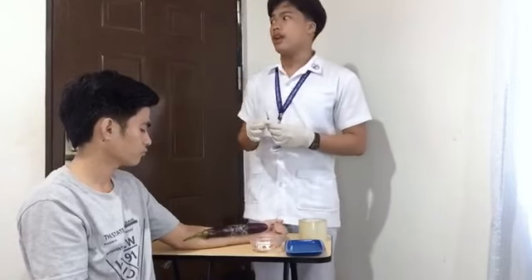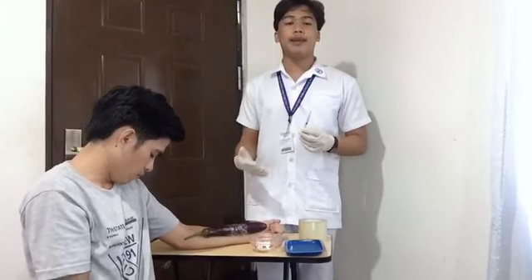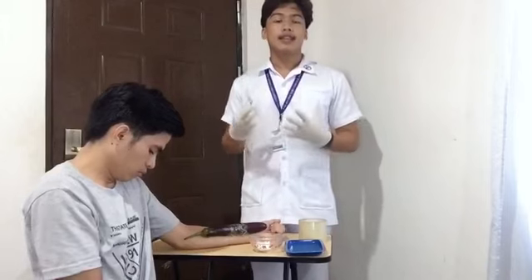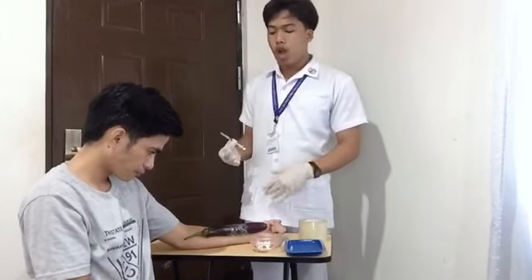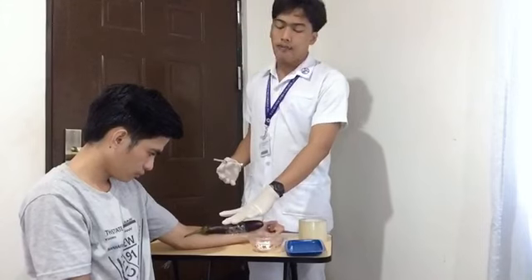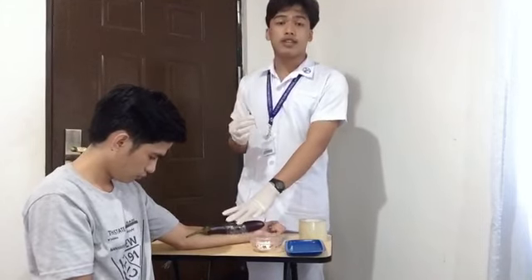And next is provide privacy. So I already closed the door so that no one from the outside can disturb us while doing the procedure. Next is select and cleanse the site. So I am going to use his forearm to inject the syringe.